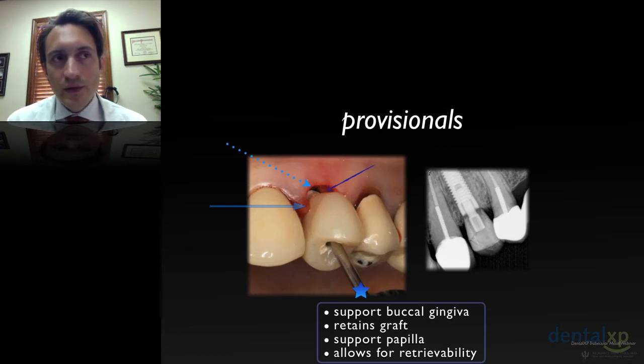Also, it seems like a lot of times we're removing the mesiodistally fractured first premolar, and we can use the facial, the buccal cusp and the buccal anatomy of these premolars and use that almost as a veneer and make provisionals that way.